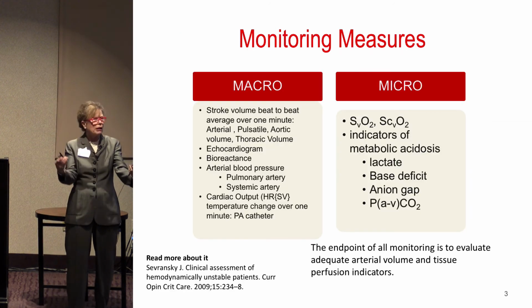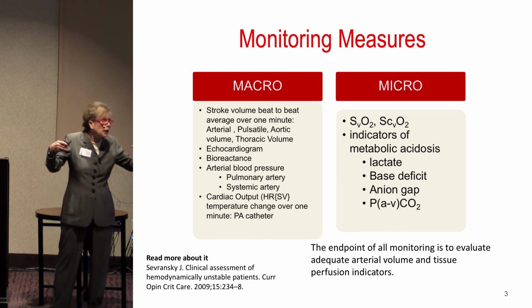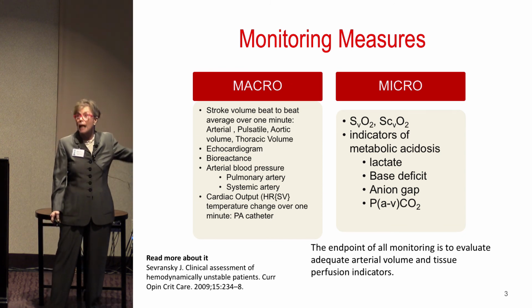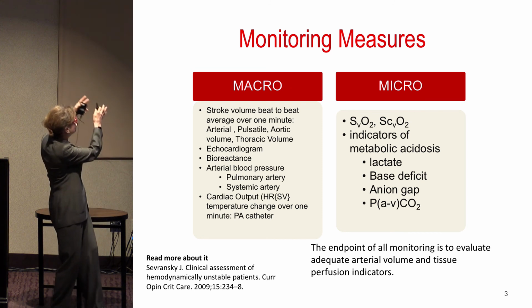I like to always make sure that we appreciate that we look at two things, and I think that we have to have a platform that combines these two. First of all, macro circulation, which is actually about your stroke volume, your vascular tone, your blood flow dynamic.